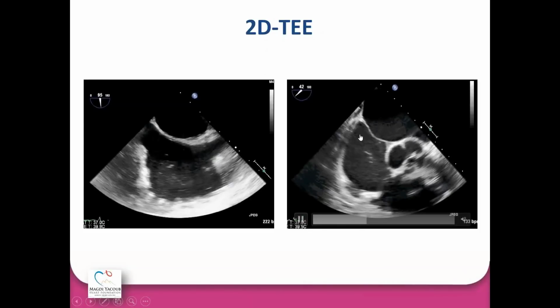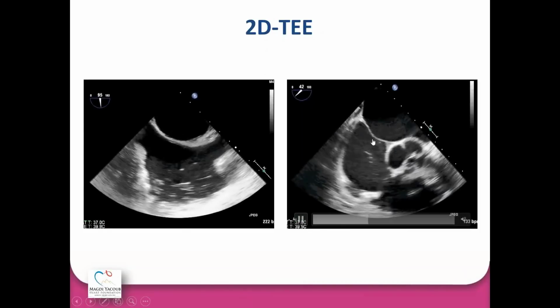As a rule, for any septal puncture at any procedure, you need to stay away from the aortic root, because if you are very close here, you can puncture the septum and go on to puncture the aortic root, which is not a good idea.